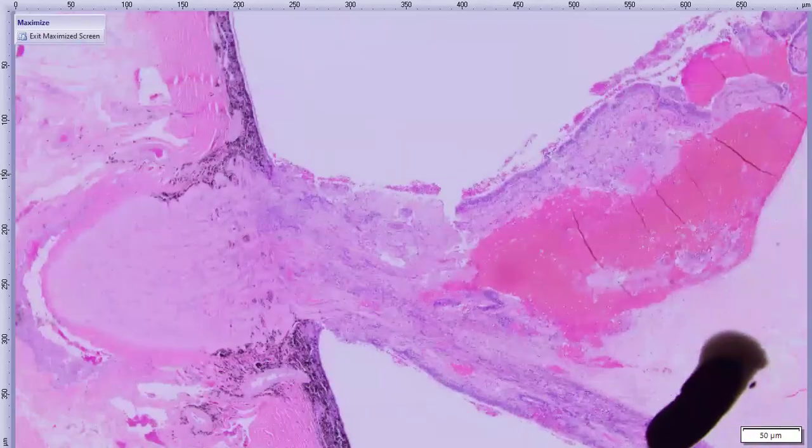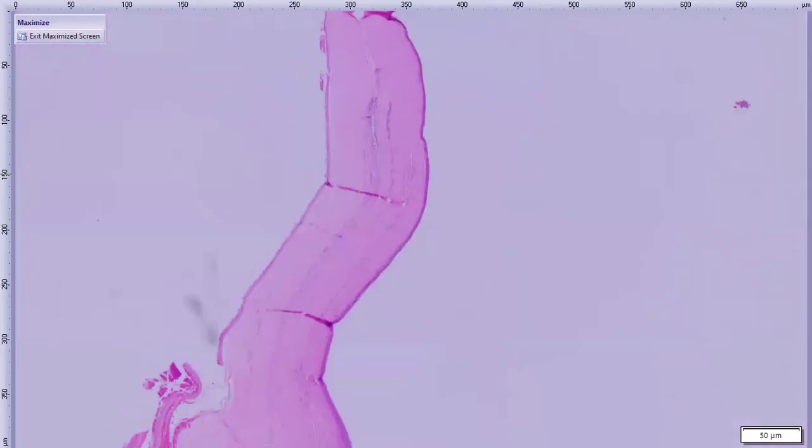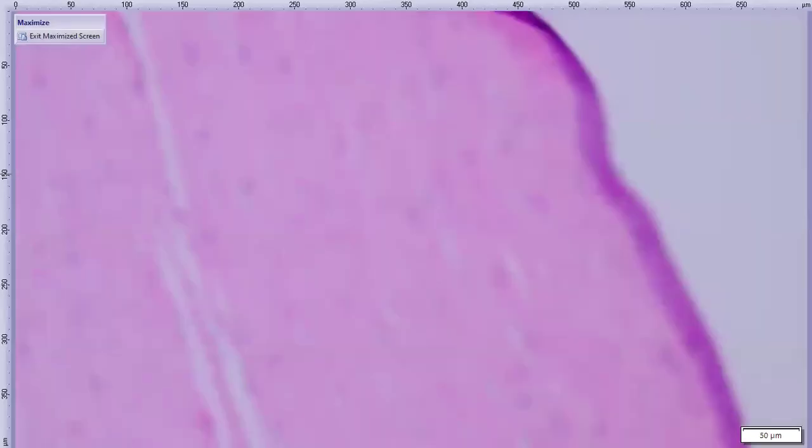Okay, so cornea is going to be on the right, posterior segment will be to the left. Really don't need to spend too much time on this cornea. There is vascularization. Maybe there's a titch of inflammation within the stroma, kind of just scattered. Neutrophils here and there. So there's a neutrophil, there's a neutrophil. Otherwise, it's mostly just vessels, which is pretty nonspecific.